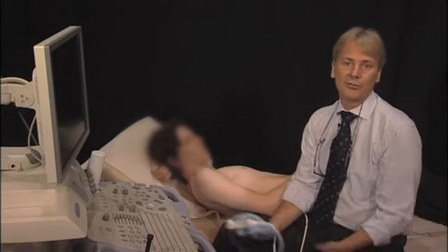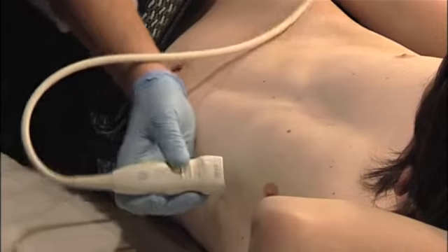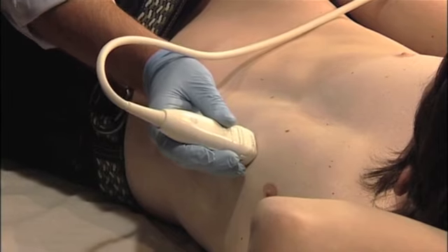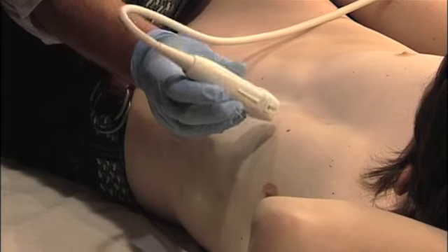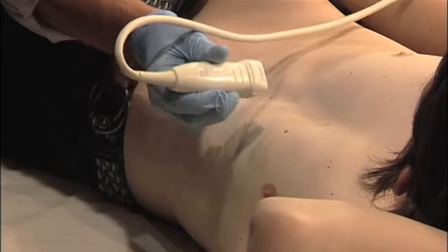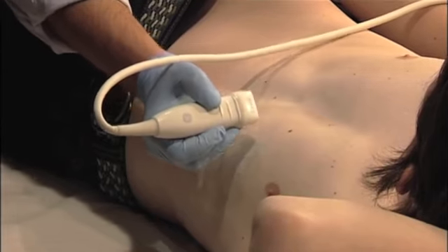So how do you hold the transducer? Well, I guess everybody does it a bit differently, and I will just show you how I would hold the transducer. The first thing which is of importance is that you hold the transducer low and not high. Thereby you have more stability and more control over your motion. The second thing is remember where the marker is. You have a little marker here, and with my finger I can feel the marker. This does not necessarily have to be the same finger all the time. For example, if I rotate the transducer, I would then feel it on the thumb, but thereby you always know in which rotational state you are.